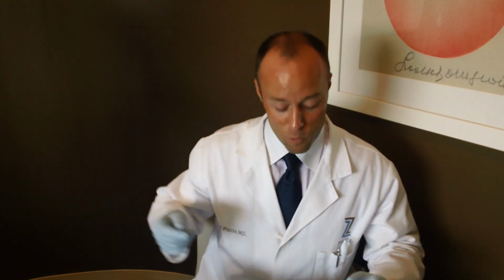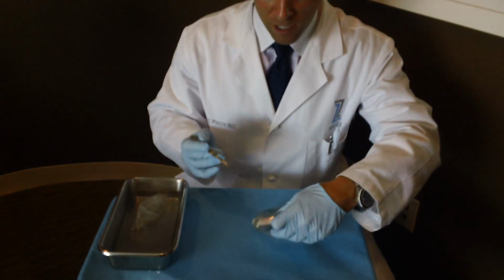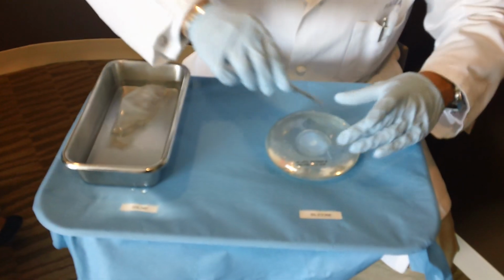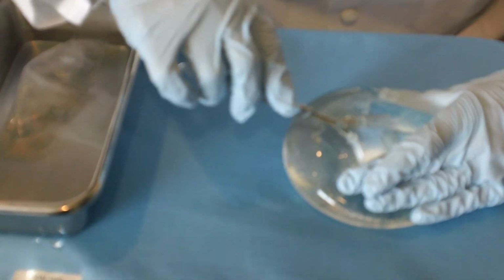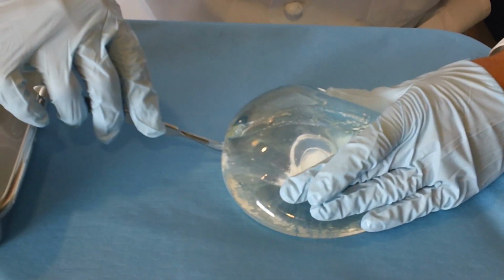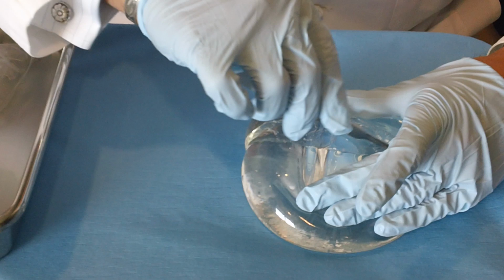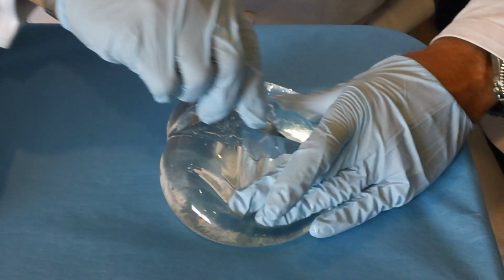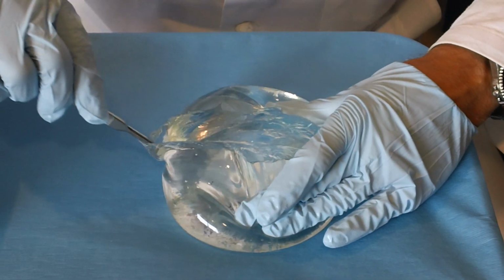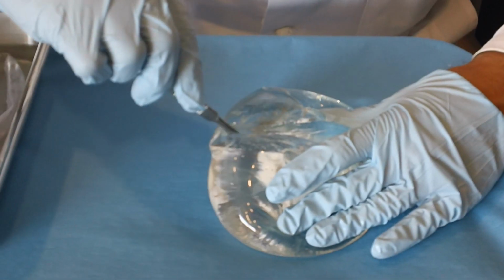I've heard stories that women complain that they're worried about silicone running out of the breast, and that's not necessarily going to happen. I'll demonstrate to you exactly what happens when we cut this in half. So what you're going to see here is I have this implant, and I'm going to take a knife, and we're going to try to cut through this implant. Okay. You can start to see that some of the inner silicone gel is now being exposed, and it's a little bit difficult to get through, but we are getting there.